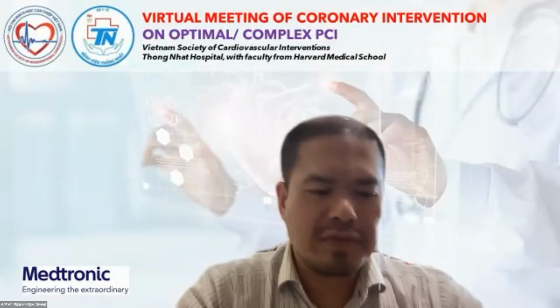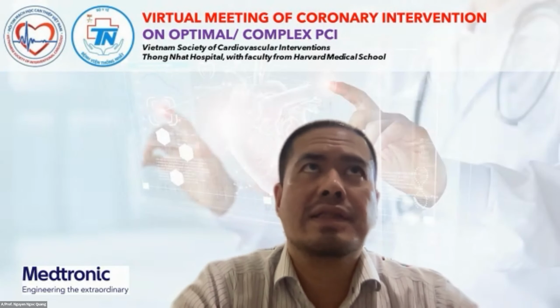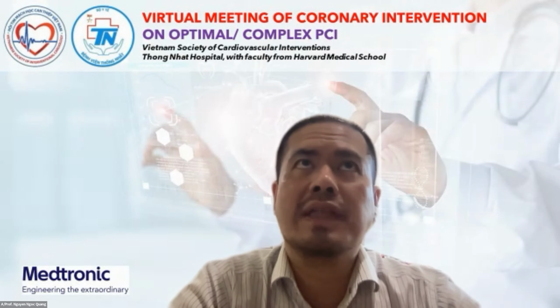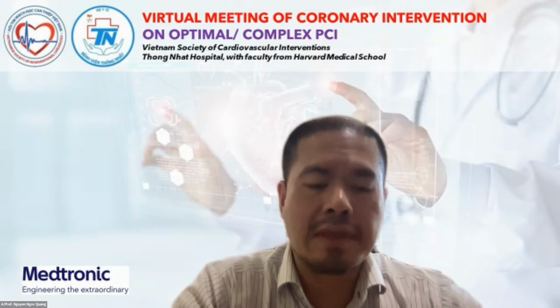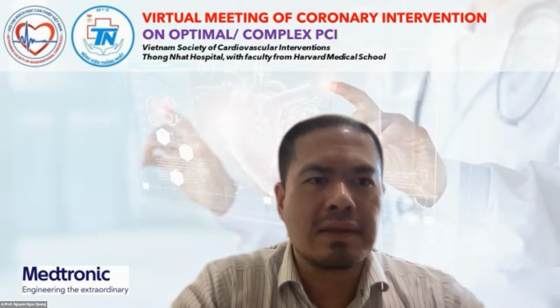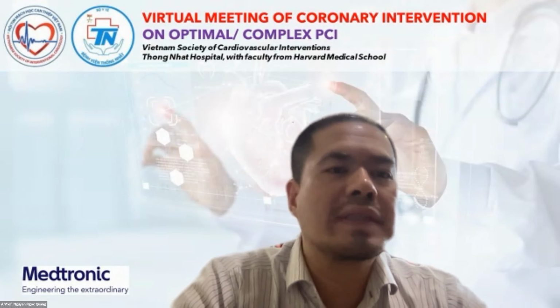Thank you very much for the comment. So basically, we see there are some advantages and also disadvantages of the OCT and IVUS. And for practicality, maybe the IVUS is more practical in reality when you do more complex lesions in the proximal part. So I would like to have the comment from Professor Hồ Tường Dũng.